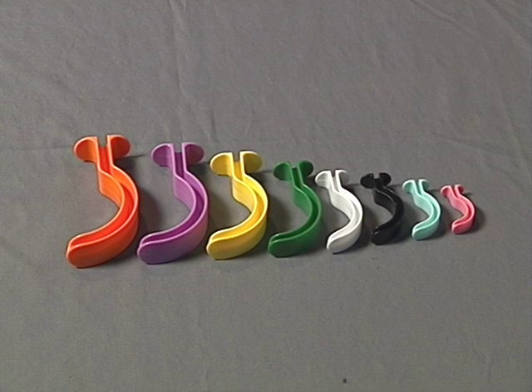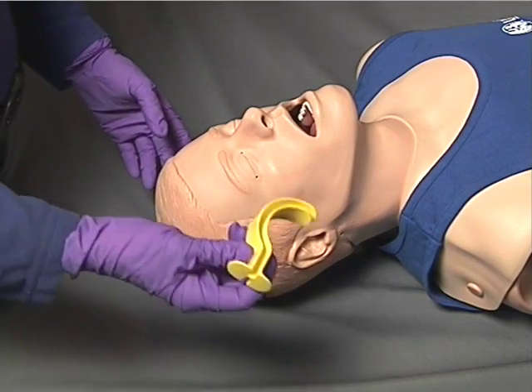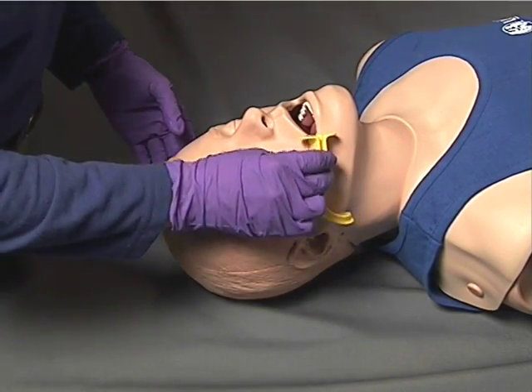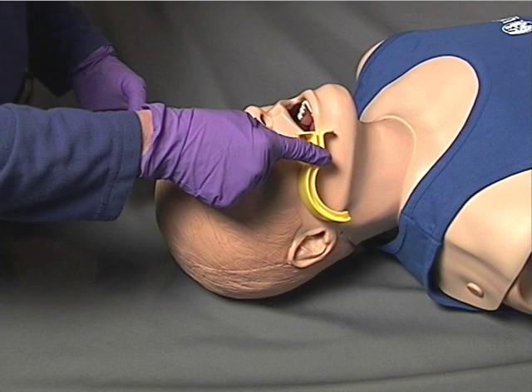Oral airways come in a multitude of sizes, so the first step to using one is to determine the correct size for your specific patient. The way to determine the appropriate size oral airway for an adult patient is to measure the airway against the side of the patient's head. The oral airway should extend from the corner of the patient's lips to the bottom of the earlobe or the angle of the jaw.